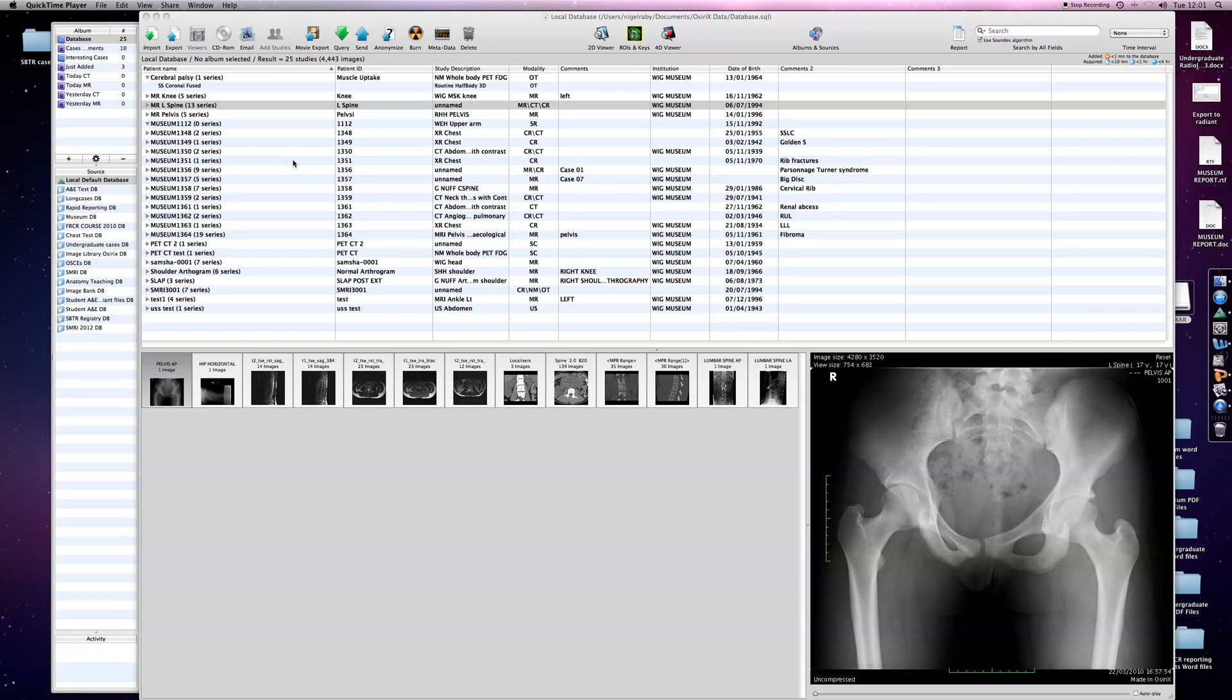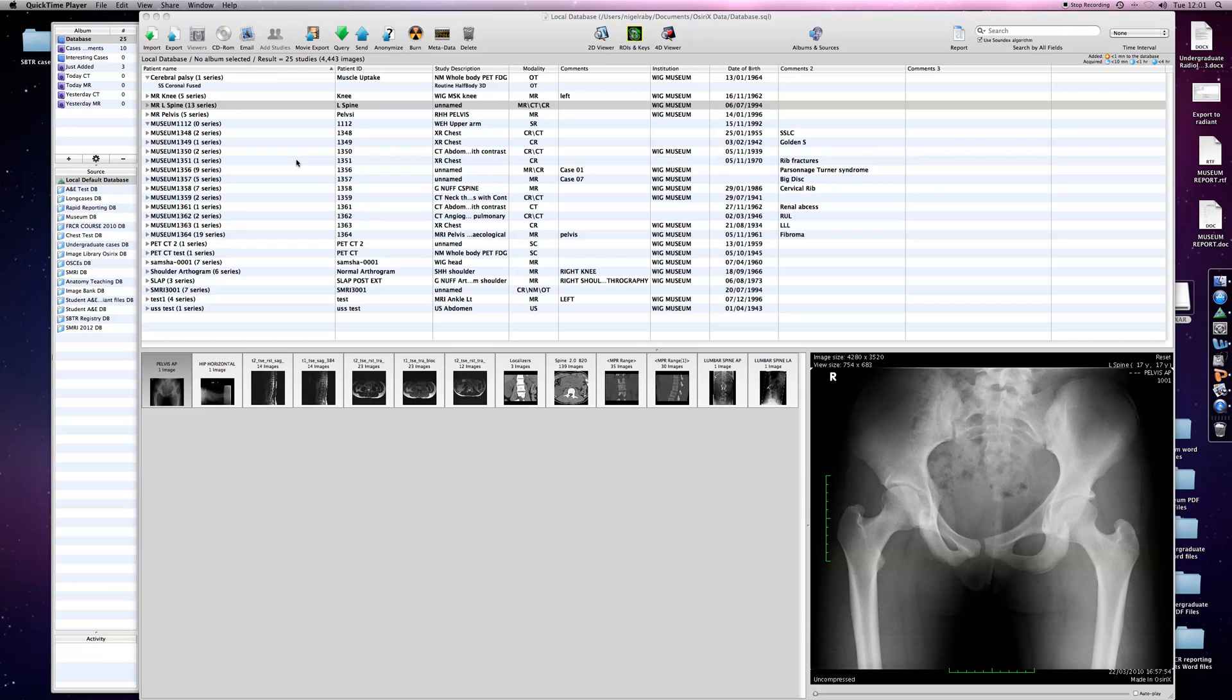This is Nigel Ravey again here in Glasgow, and I'm going to show you how you can use OSIRIX to add content on top of images. I would use this particularly in constructing museum-type cases.